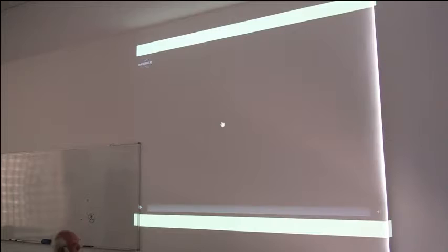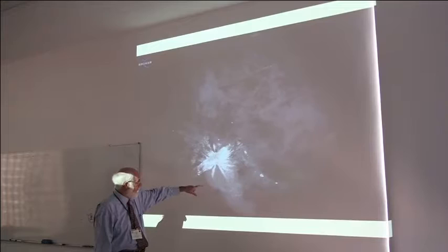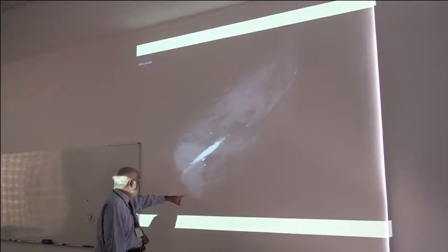So now we have a computer image analytics problem. Here you're looking at a lumpectomy specimen. This is a wire that's put in the patient and that lets the doctor know where the cancer is. And after you look at this for a while, the eye begins to appreciate that this is the cancer. And this flaky stuff is normal tissue.